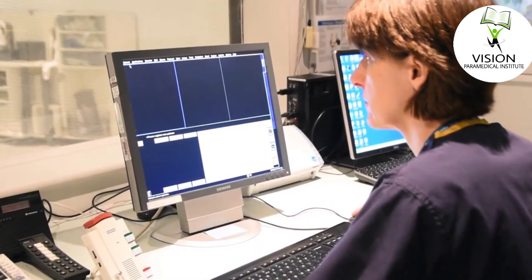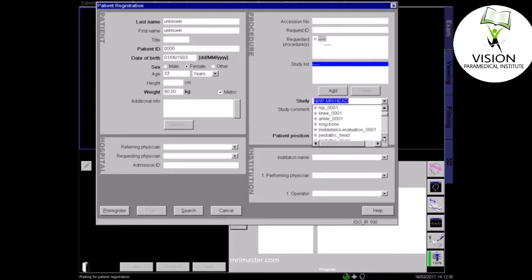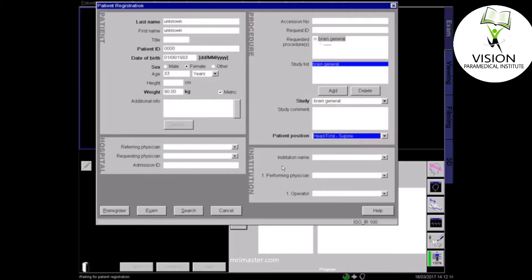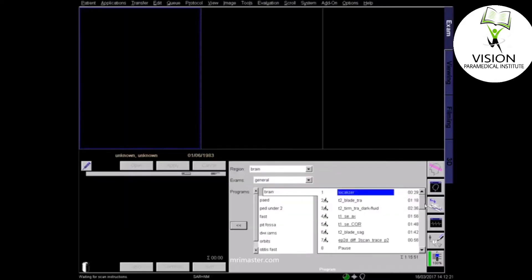Once you're back in the control room, select the correct patient details in the browser, or you can type them in manually if necessary. It's very important to get the details right, including the correct patient weight, so that the SAR can be calculated accurately. Register the patient as lying head first and supine. Select the correct protocol according to your hospital and radiologist guidelines.